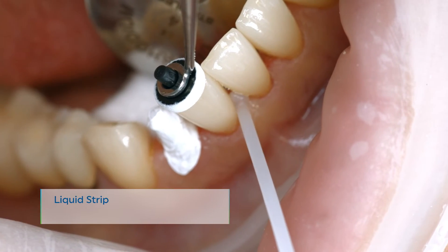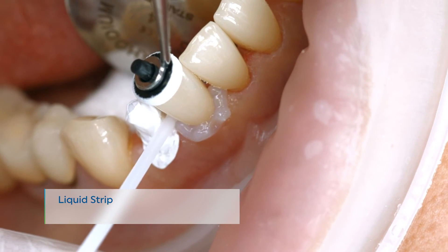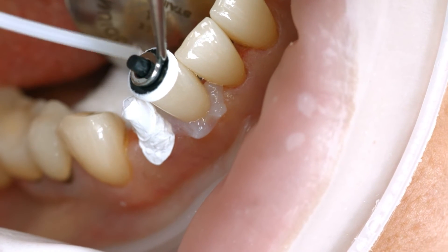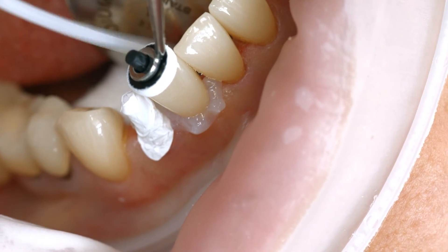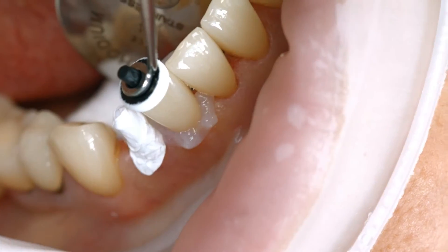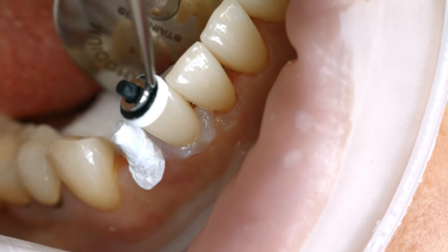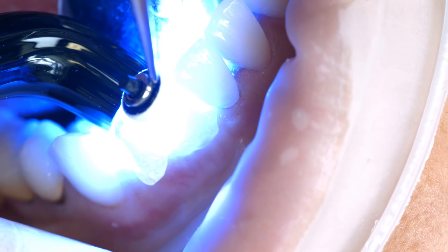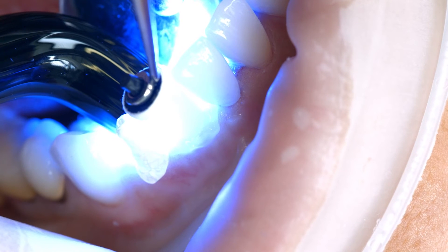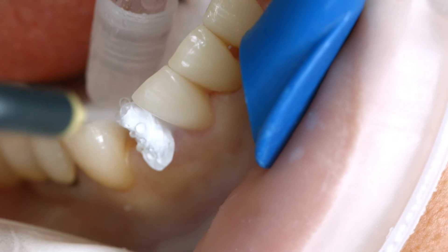Like all other composite resins, Variolink Aesthetic DC is subject to oxygen inhibition. To counteract this effect, cover the restoration margins with glycerin gel or air block immediately after having removed the excess cement. Liquid Strip is an ideal product for this purpose. Light cure all cement lines again for 10 seconds per segment and per mm ceramic — using, for example, blue phase style at a light intensity of 1100 mW per square centimeter. Then rinse off Liquid Strip.